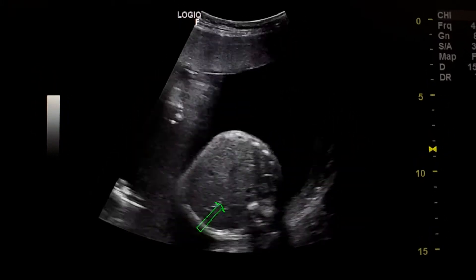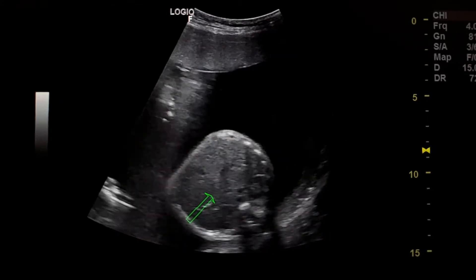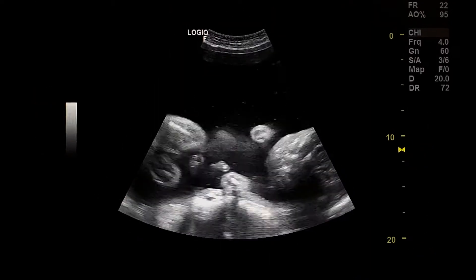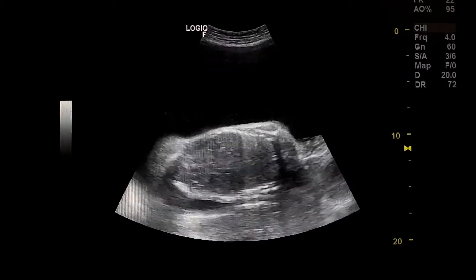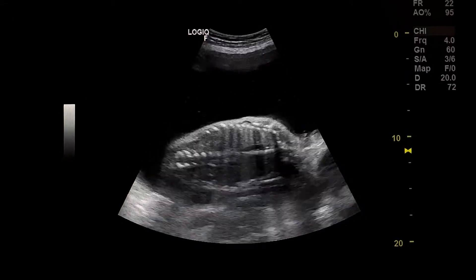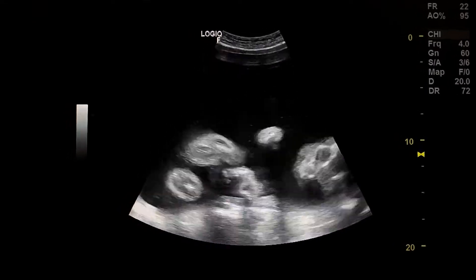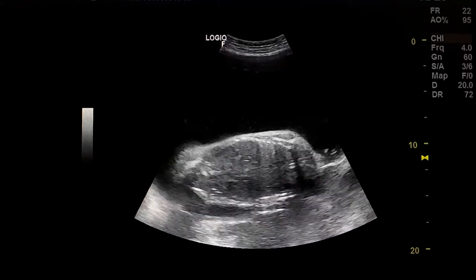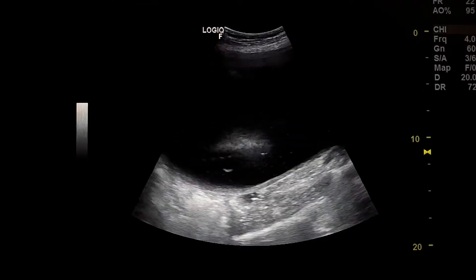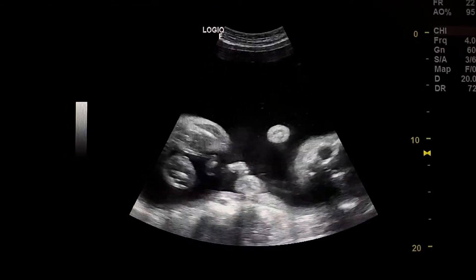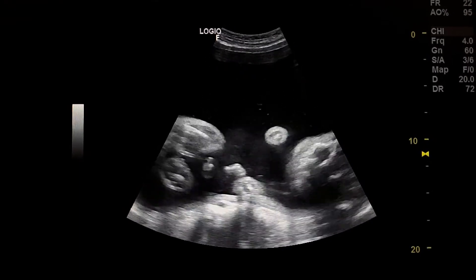Scanning the abdomen transversely, this fetus of a 40-year-old pregnant woman has at least three anomalies: first is esophageal atresia; the second is congenital heart anomaly; and the third is single umbilical artery.